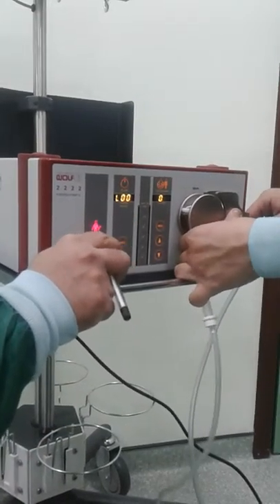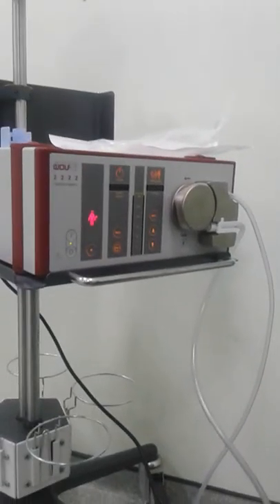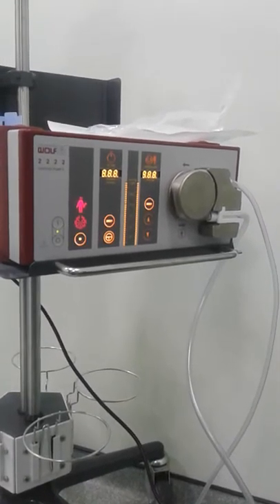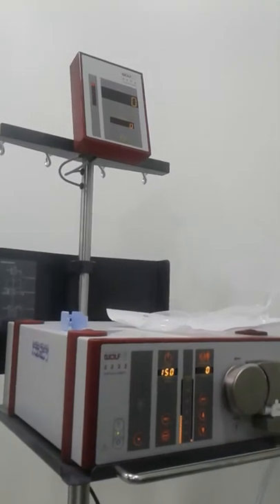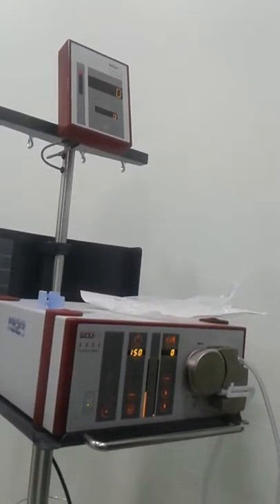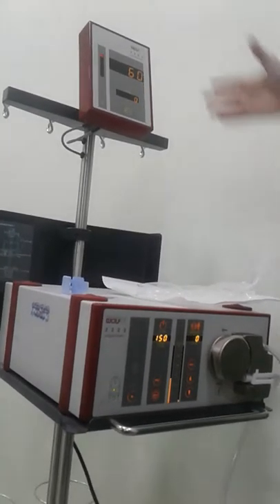Maybe this sign is for the maintenance service mode. Yeah, I know. See, the problem was the tube. They used the tube before. Okay, it's a single use. Is there any sensor inside so it can detect it has been used before? Yeah. This is the pressure chamber. Okay. I think the monitor is working.